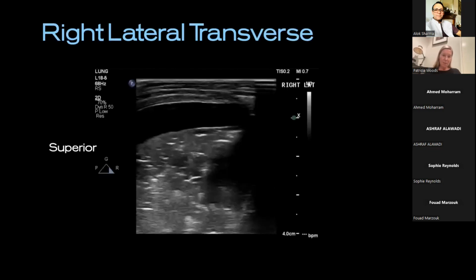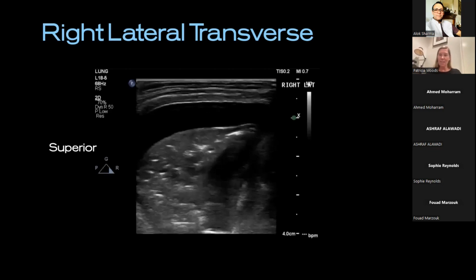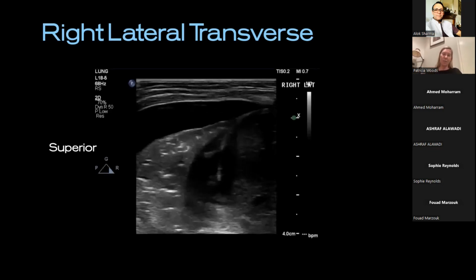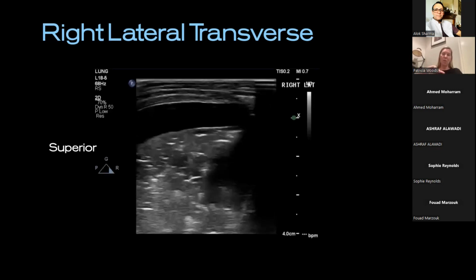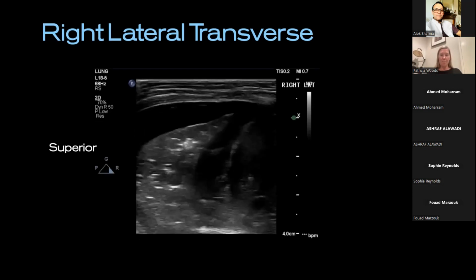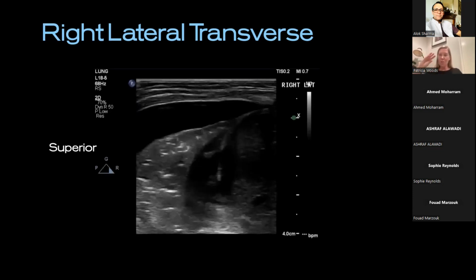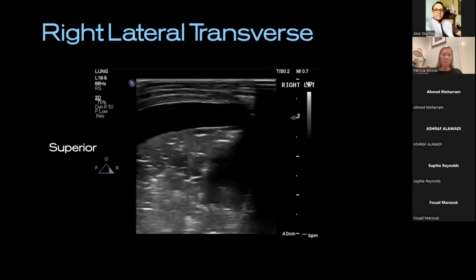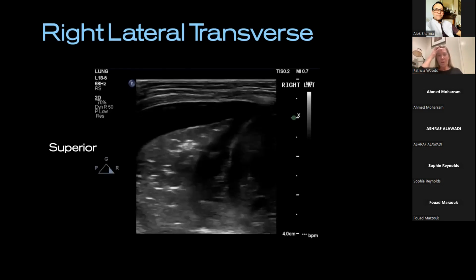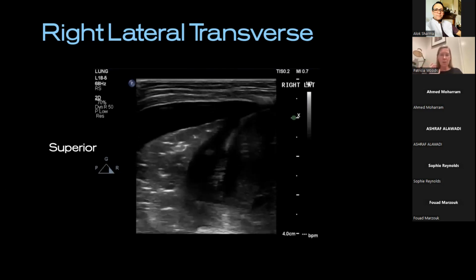This is another view. So this is in a transverse plane. So again, this is a sideways slice view of the costophrenic angle. Put simply, chest wall, crescent shape of fluid. You've got diaphragm coming into play, and this little blob of lung that you can see is so atelectatic now, probably hepatized in the center. It's very hard to differentiate true atelectasis and consolidation.